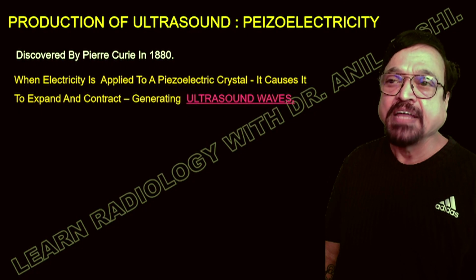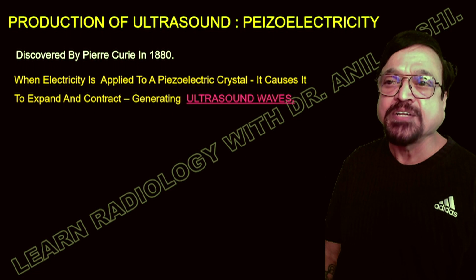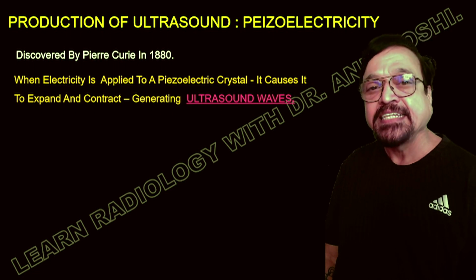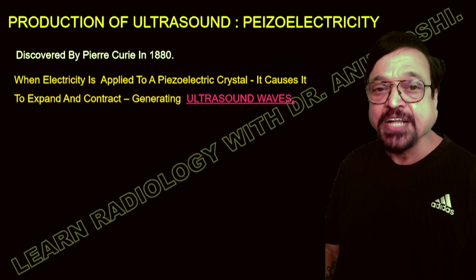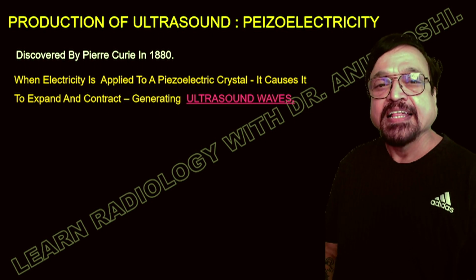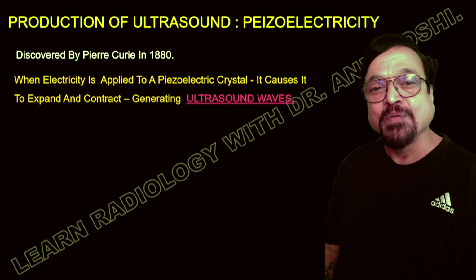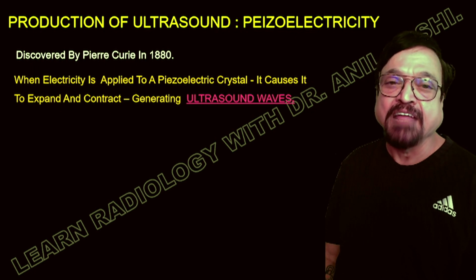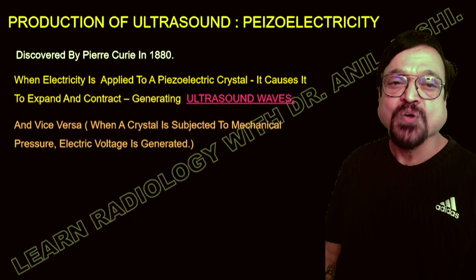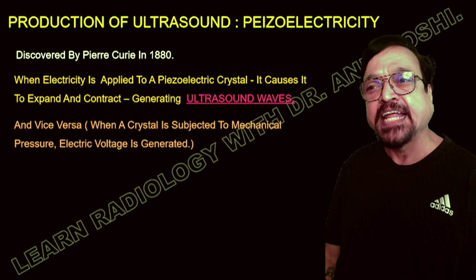Now, when electricity is applied to the piezoelectric crystal, it causes it to expand and contract. That is a vibration. Electric energy sets a quartz into vibration, and then electricity is converted into ultrasound wave by a phenomenon called the piezoelectric effect, and the crystals which have these unique characteristics are called piezoelectric crystals.